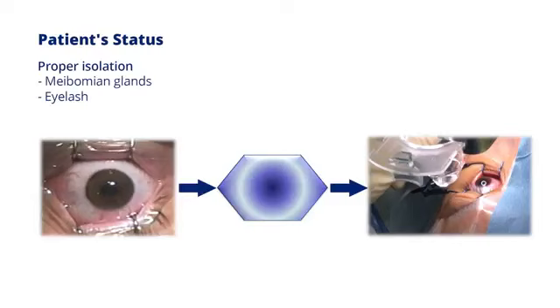To make the sclera equal, it's very important to have equal sclera with space enough for suction ring insertion. Be careful of loose conjunctiva to be entrapped into the suction ring to avoid pseudo suction.